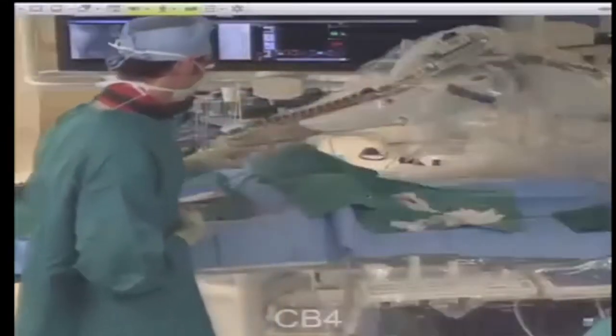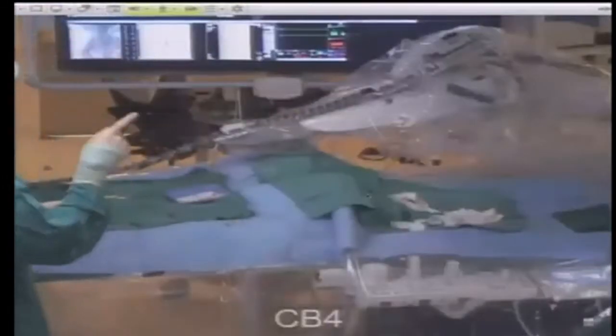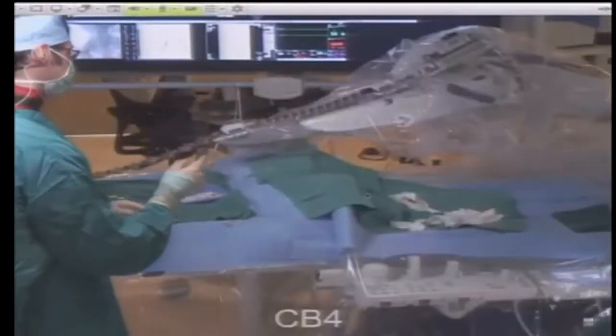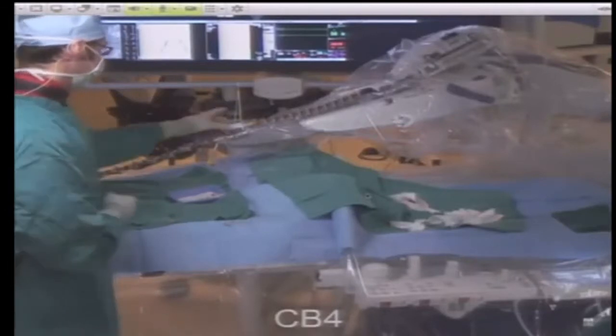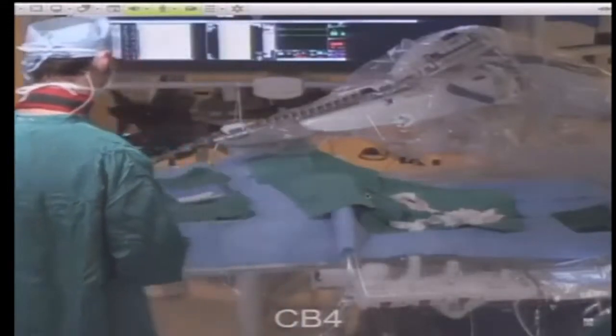We have what's called the RCM here, which controls the robotic catheter. There are two cartridges that attach on either end. One controls what's called the leader, which is the finer of the two catheters, and telescopes through the sheath, which is controlled by the other cartridge. The cartridges essentially have four wires that permit flexion — actually six degrees of freedom.